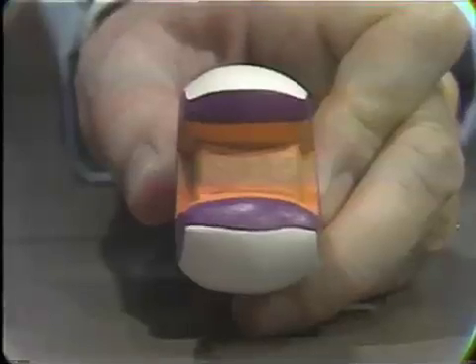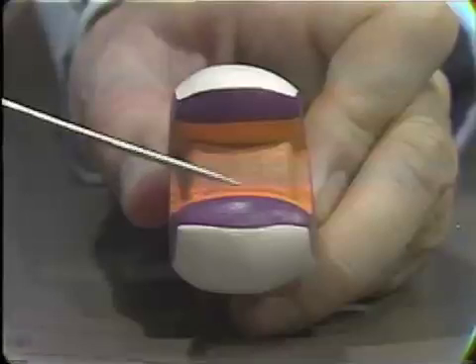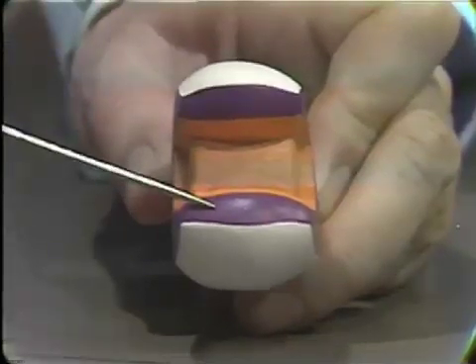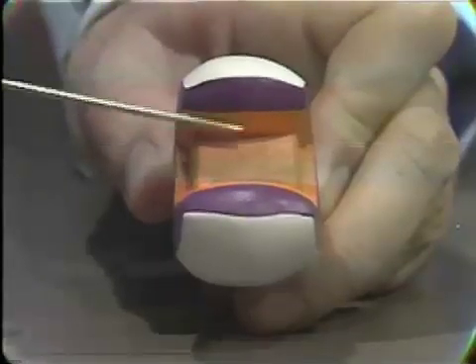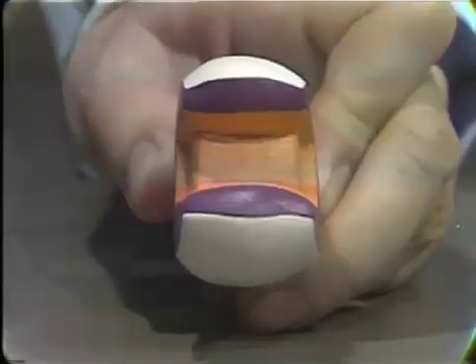And perhaps the most conservative way of converting it into a bridge retainer is to utilize essentially that preparation and just to give occlusal protection to the cusps, rather than perhaps, say, going to a three-quarter crown and cutting away more of the lingual cusp, which is already perhaps somewhat cut away by the previous preparation.